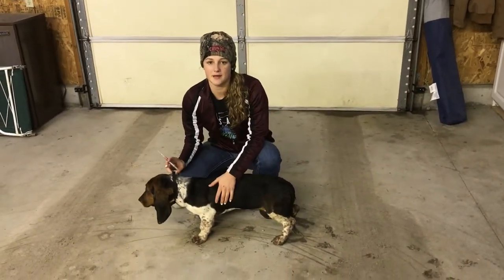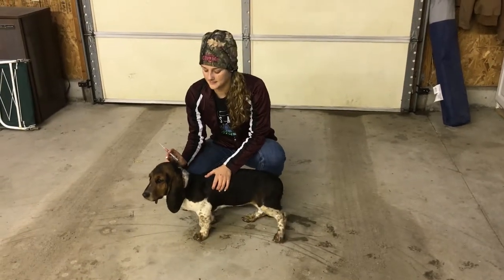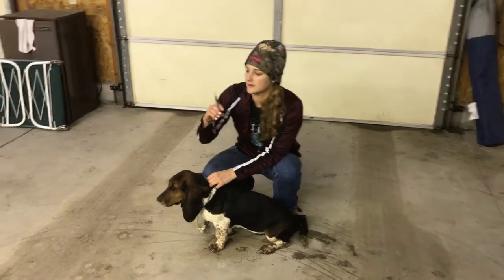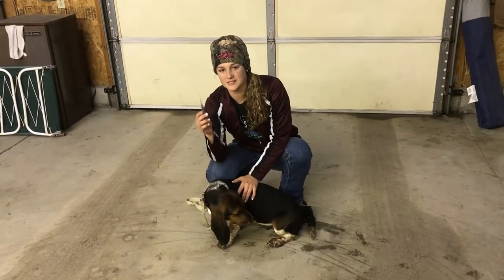I'm going to be giving this basset hound pup her distemper shot. This shot is supposed to be given subcutaneously. First of all, you're going to want to make sure there's no air in the needle, and then I'm going to be giving her this shot with a 22 gauge needle, which is an inch and a half long.